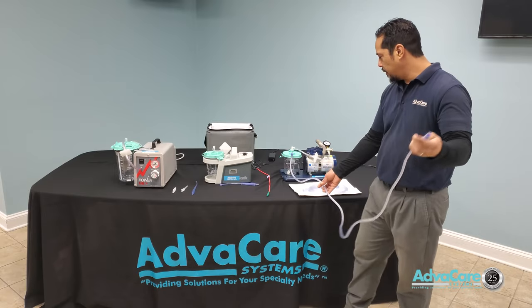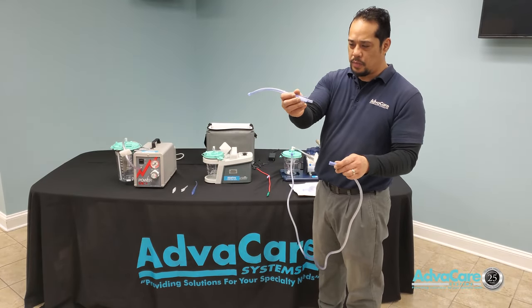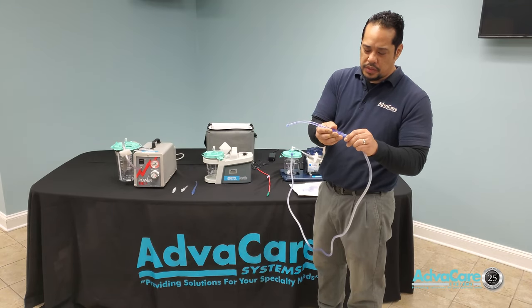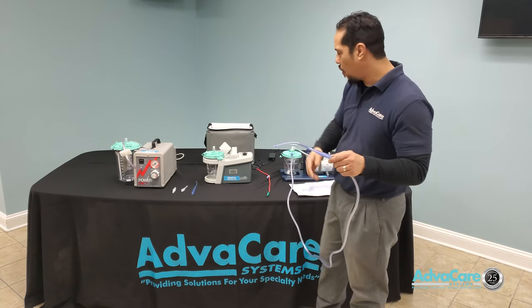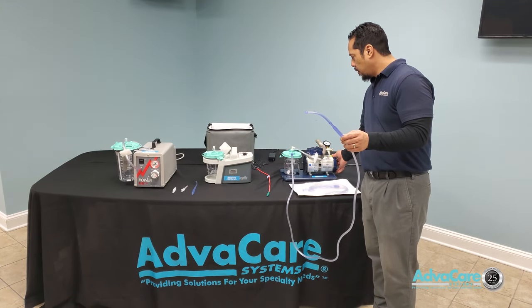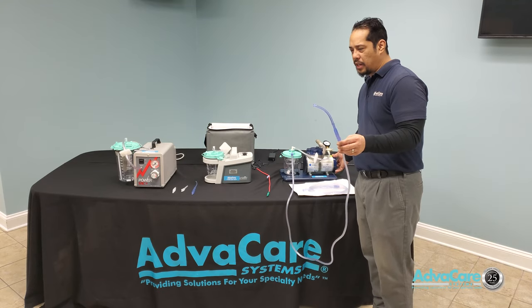Once everything is in place with tubing connected, you have your Yankauer with ball tip connected to the front side for oral suctioning to help clear anything out of the oral passage. You can then turn on your machine and be ready to perform suction therapy.